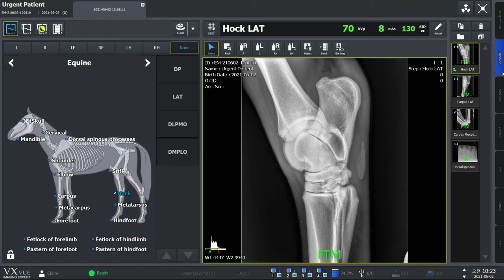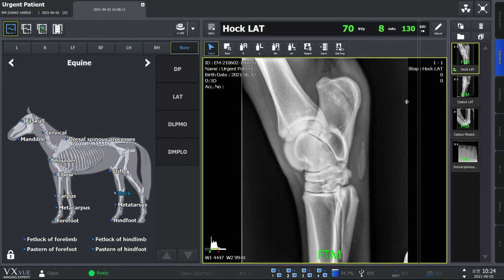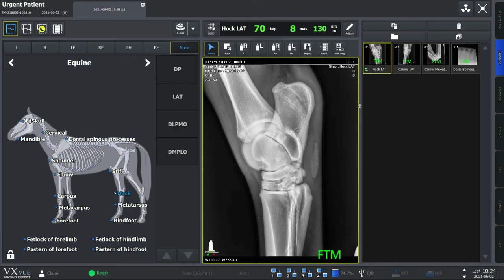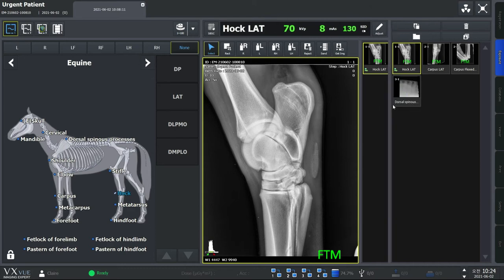Please note that FTM mode is supported for limited detector models only. Expanding thumbnails is a simple yet one of the most needed functions. Simply click on the bar here and drag it to the left. This enables you to customize the number of thumbnail rows up to four rows.